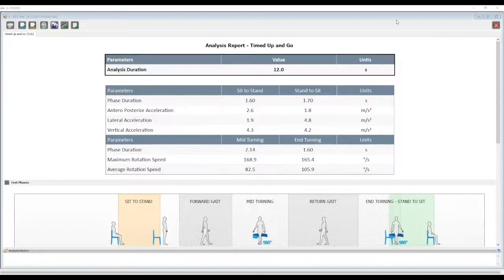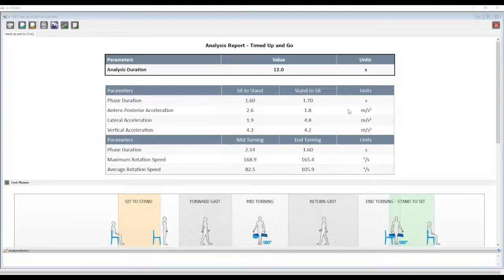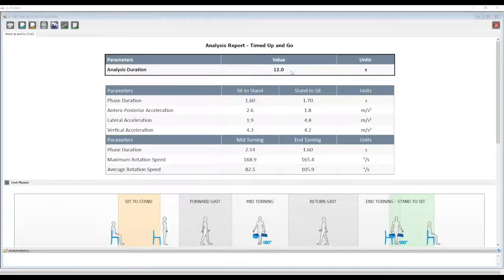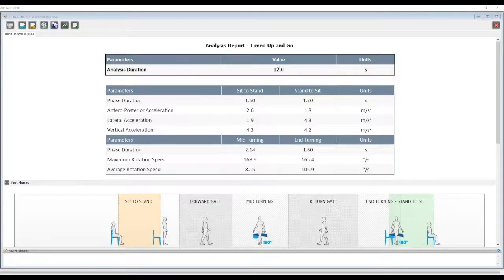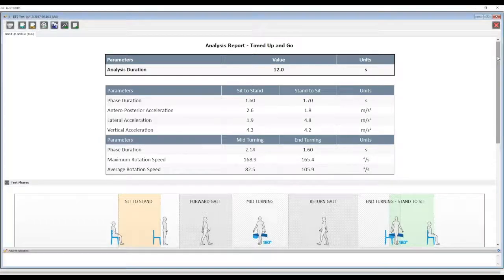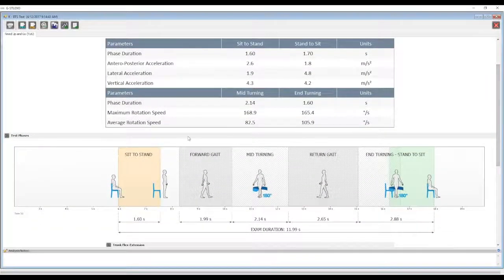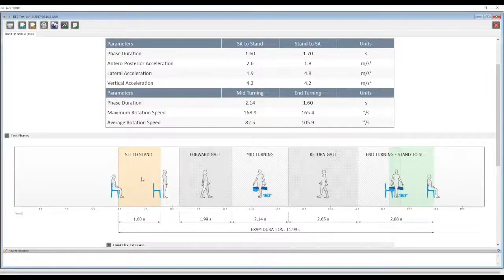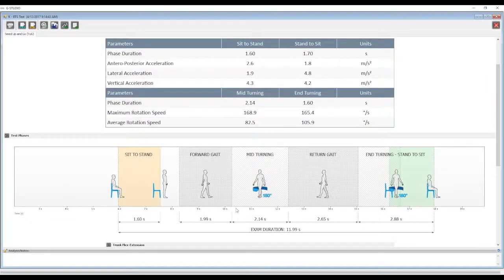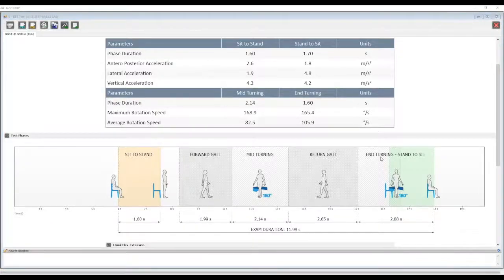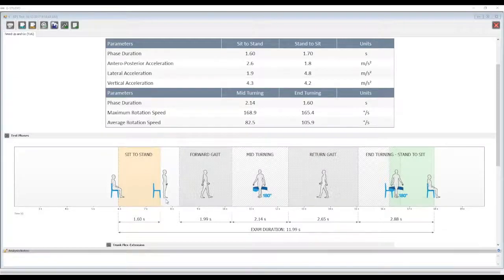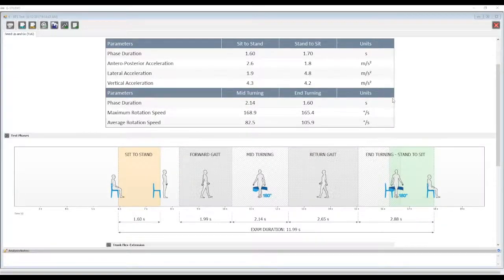And as soon as you save the data, it automatically is added to this clinical report which is generated. So as you can see, the total time is provided of the test, and this is typically the only information that is provided. But in addition, we get all of this other information, for example the duration of each sub-phase of the test, and even information about whether different sub-phases overlapped or if there was a moment where they were standing still before beginning their gait.